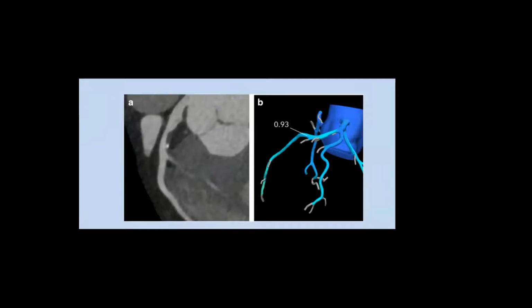But now cardiac CT for coronaries, and it is starting to take over or at least to compete with cardiac MRI in other things, ischemia, viability, and stuff like that, besides the refinement of coronary artery assessment. So it's not only morphological assessment. We can give functional assessment by FFR. So that will be great. You can have ischemia assessment by CT as well.